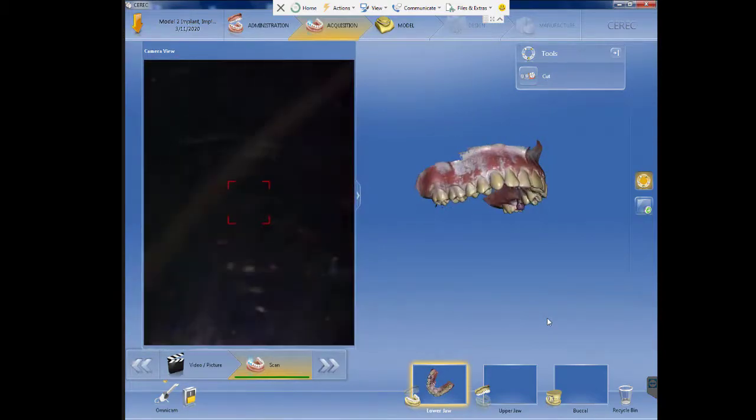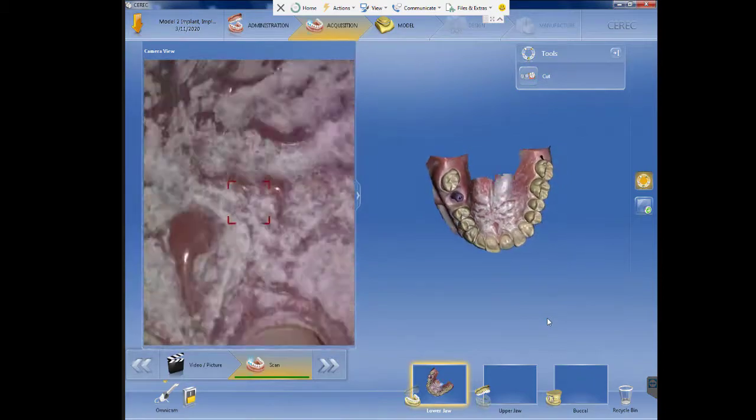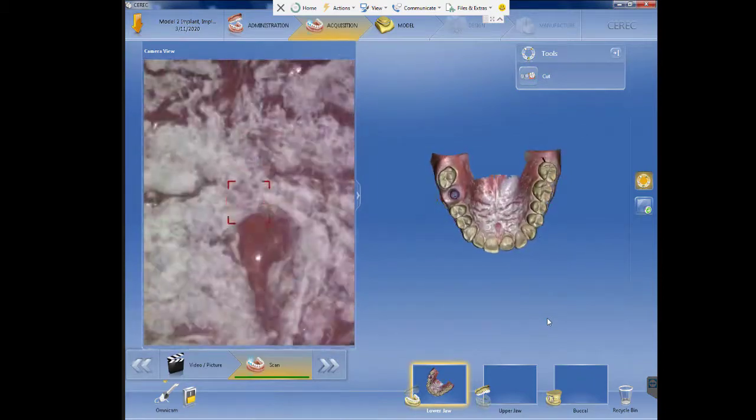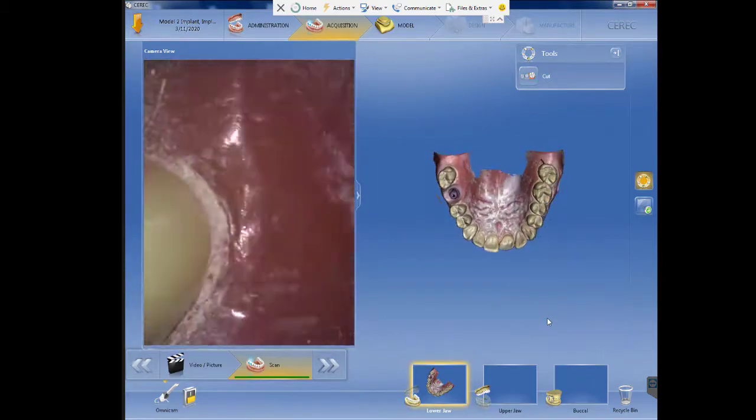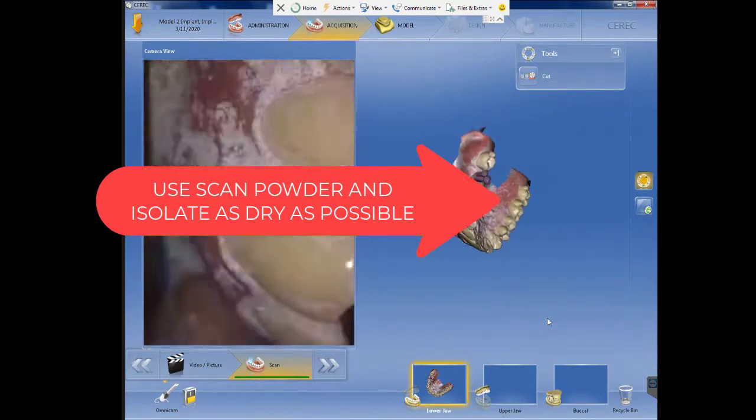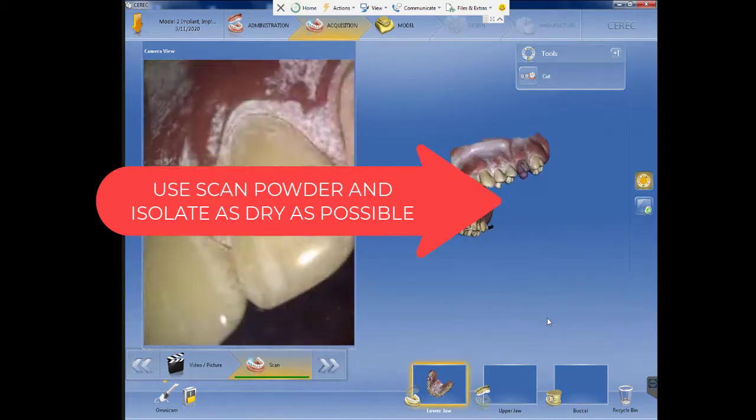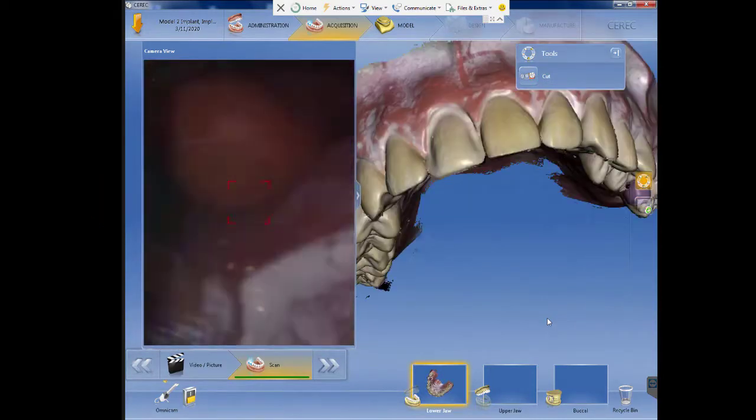This can be done with any intraoral scanner in the market. For better results we suggest to use scan spray and any isolation as Optragate or Isolite.